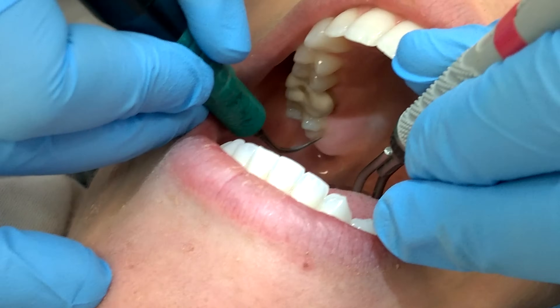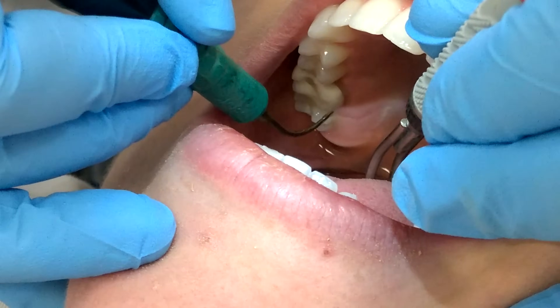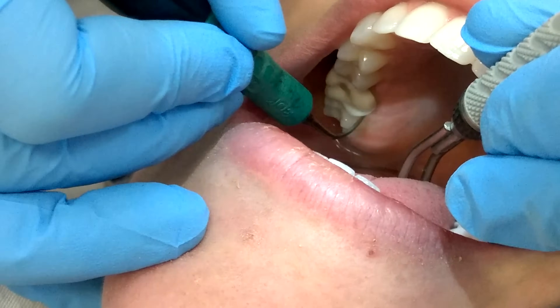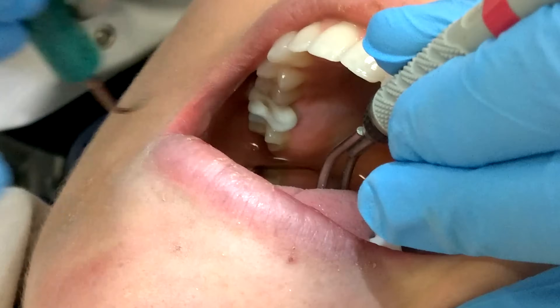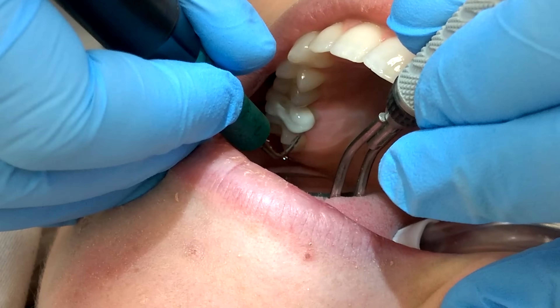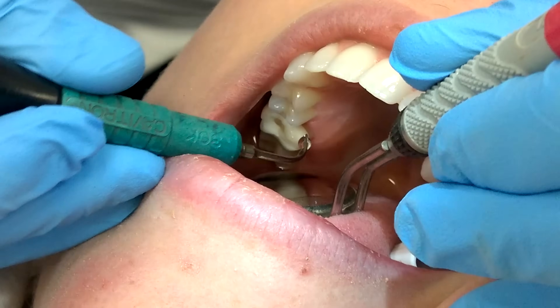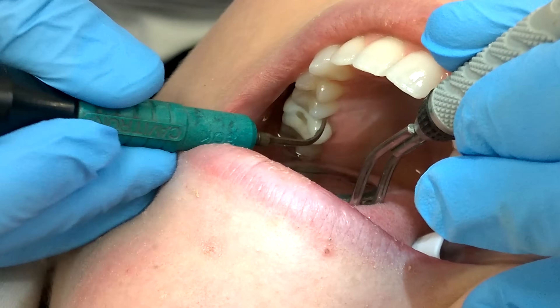When you're working with indirect vision and you have the ultrasonic, it usually creates a lot of splatter on your mirror. The way to prevent this is to spray your mirror down with your ultrasonic tip. This creates a film of water over the top of your mirror so that it absorbs any splatter and you'll be able to see better.